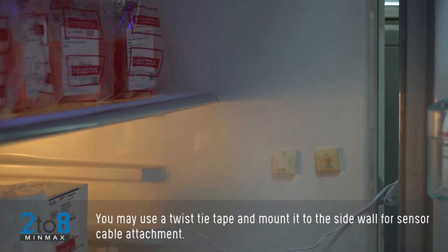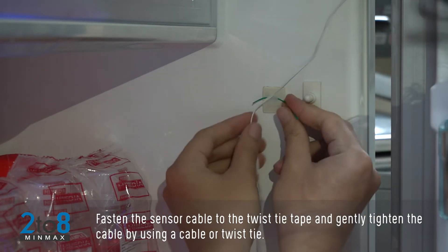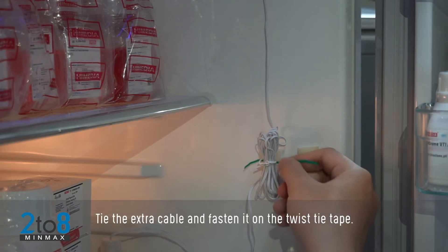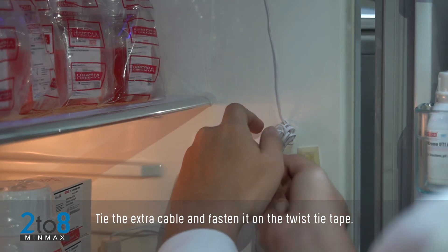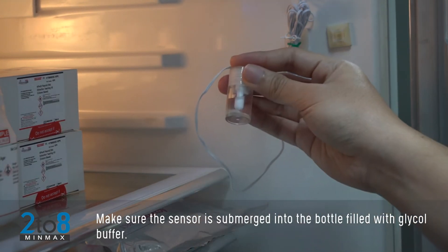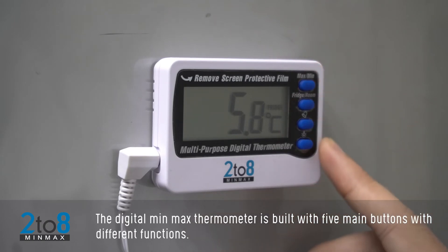You may use a twist tie tape mounted to the side wall for sensor cable attachment. Fasten the sensor cable to the twist tie tape and gently tighten it using a cable tie. Tie the extra cable and fasten it on the twist tie tape. Make sure the sensor is submerged into the bottle filled with glycol buffer.